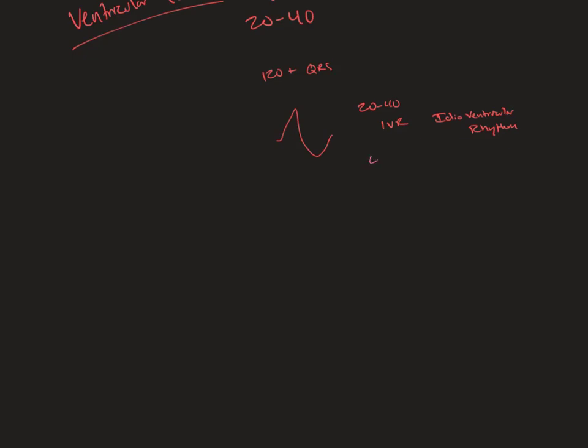If it's between 40 and 60 and it looks like this, you have an accelerated IVR. Let's actually go with 40 to 100 for an accelerated IVR. And if you're 100 plus and it looks like this, it might look familiar.